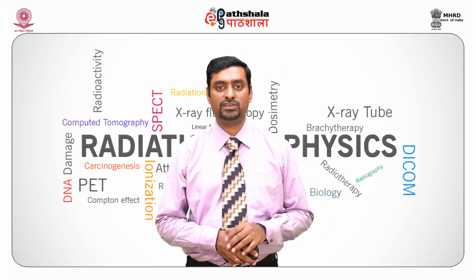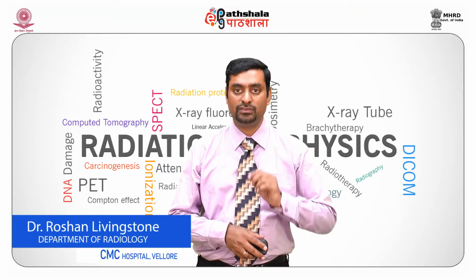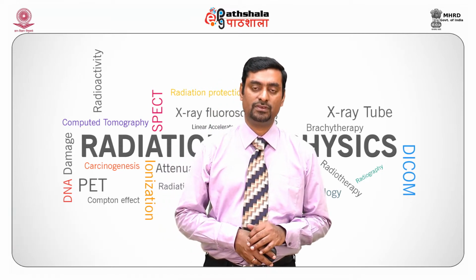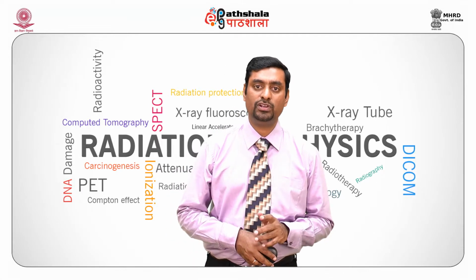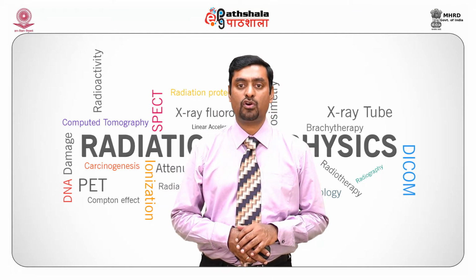The X-ray tube potential for imaging the soft tissue ranges from 20 to 35 kilovoltage depending on the thickness of the breast. Molybdenum target is used for smaller breast thickness. For breast thickness above 6 centimeter, rhodium target can be selected. Then we have the filter. The use of filter is to enhance contrast sensitivity.